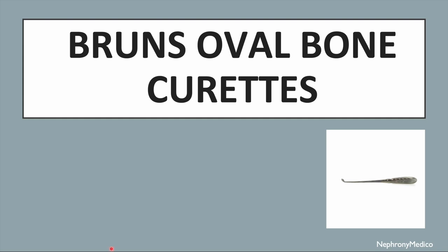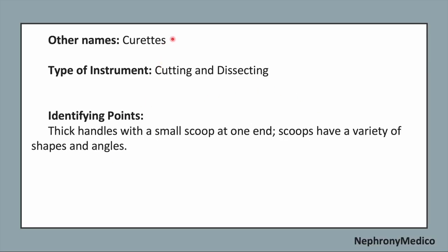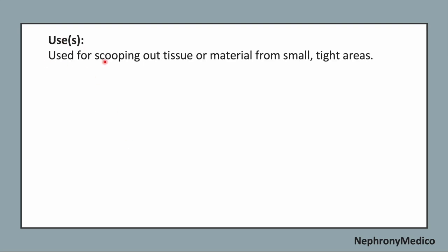Let's talk about Bruns oval bone curettes. This is a picture showing Bruns oval bone curettes. The other name of this instrument is curettes. It is a cutting and dissecting type of instrument. Identifying points: the thick handles with a small scoop at one end, and the scoops have a variety of shapes and angles. Use: it is used for scooping out tissue or material from small tight areas.